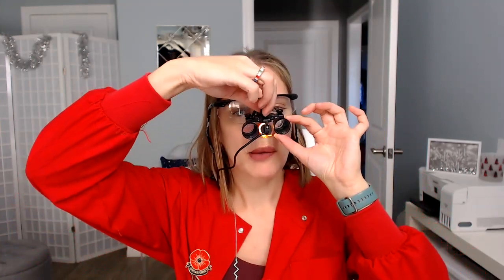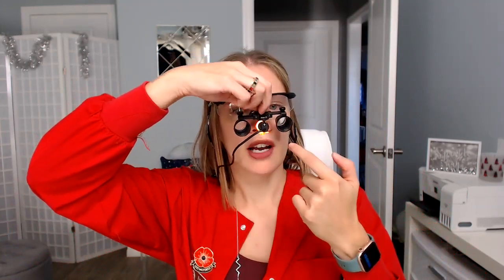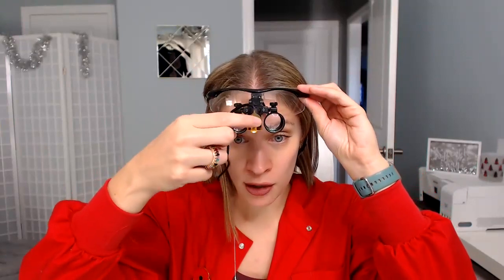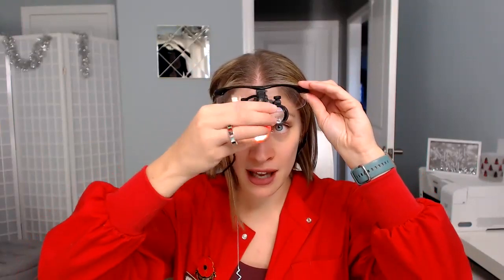What you do is you put them on and there's a little knob here. You see how these are moving further out? Mine are usually right at the closest it can get. You adjust the light to how your patient is — some patients are taller, some are shorter. You're going to need to adjust the light.